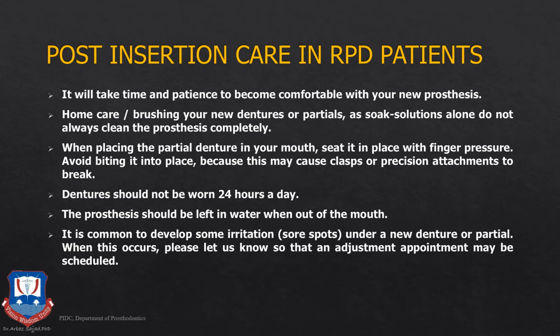When the denture is placed in the patient's mouth, the patient should seat it with proper, firm finger pressure, and he should avoid biting it into place because this may cause the clasp and precision attachment to break. The patient should be explained that dentures should not be worn continuously for 24 hours. He should remove his dentures during the night and keep them in potable water throughout the night or when he is not wearing them. Some irritation, sore spots, and ulceration under the RPD framework and base are expected and will be adjusted at a scheduled appointment after 24 or 48 hours.